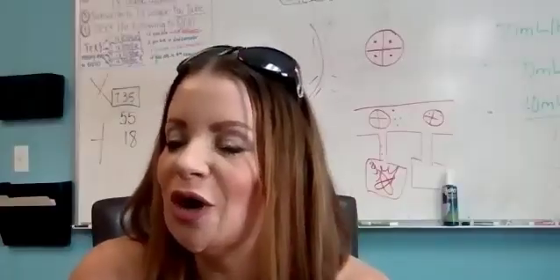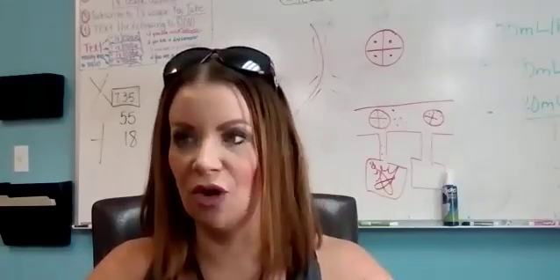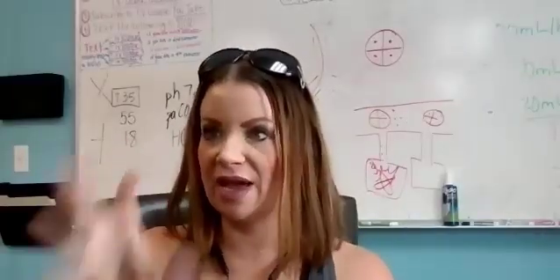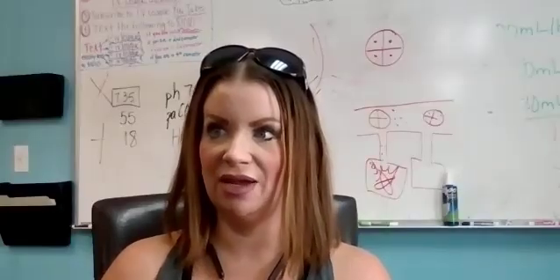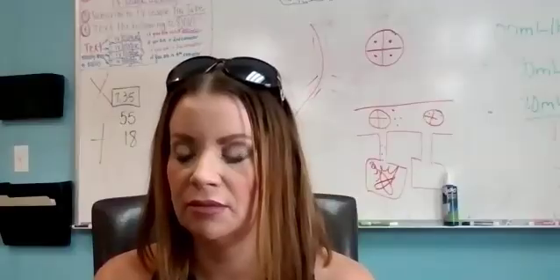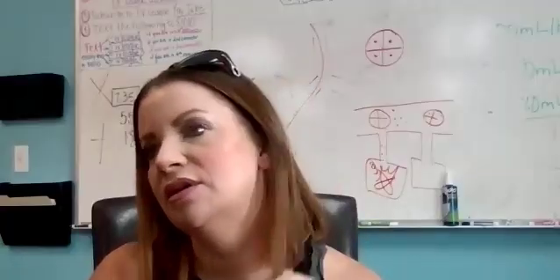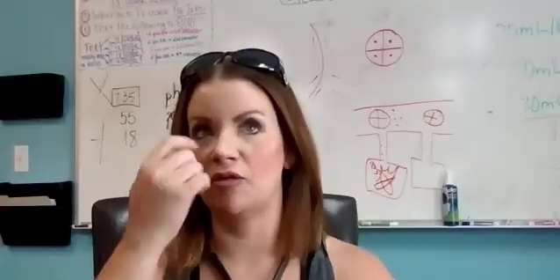So the job is to open the alveoli so that we can have gas exchange, but you're basically blowing in their nose and mouth, right? So that can cause trauma inside the lung. So we don't want to put the pressure too high, because we don't want to blow a lung. And when you're increasing pressure in the lungs, that decreases your preload. How does it do that? Not enough room. That could be true. You don't have enough room.